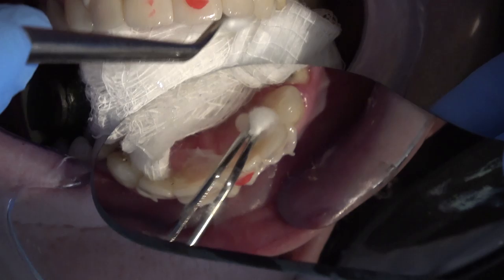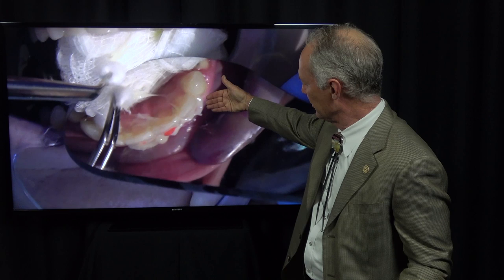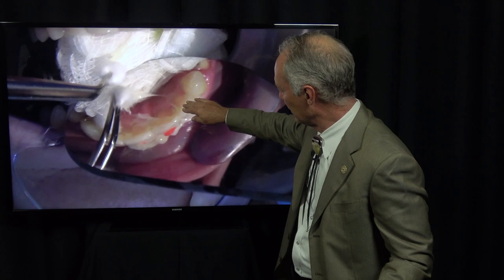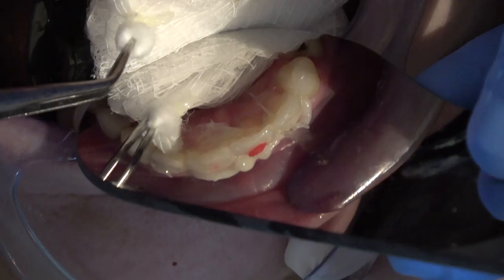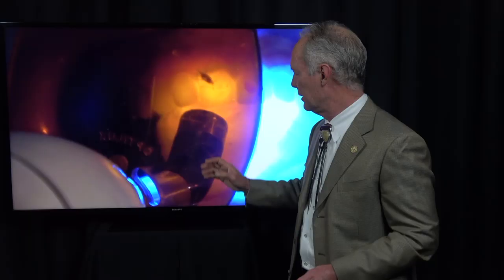See, I'm wiping this with a cotton ball and using a large occlusal mirror to be sure that these are in the correct arch alignment and that they're completely seated on the palatal. Then I'm going to push into place one more time so that that micro gap is completely filled. Then this is a very important part. This is how you get initial cure of the luting composite.